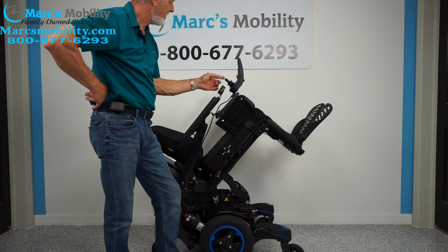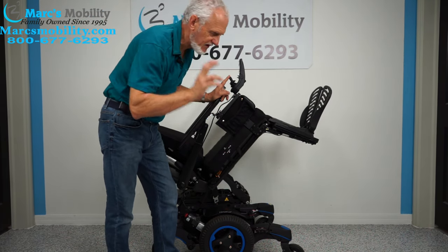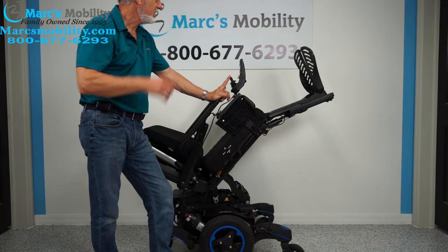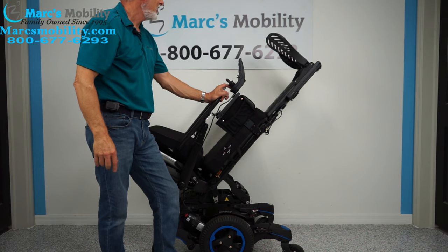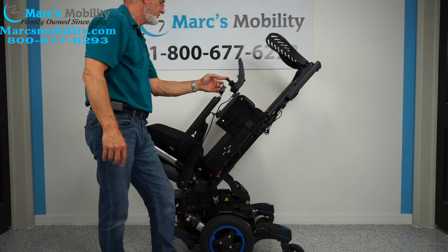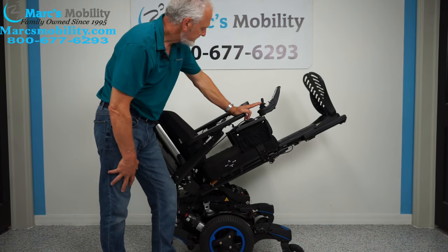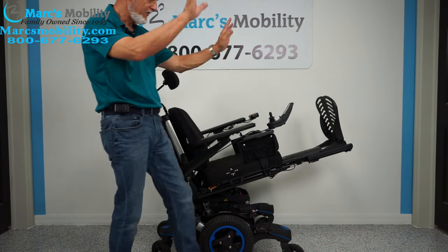The next function is the electric feet. If you're five feet tall or six foot two, we can adjust the legs up and down the track. Even when the seat is only tilted partway back, you still have your feet higher than your body — you don't have to go all the way up to get the benefit.